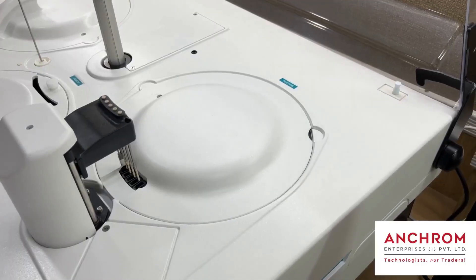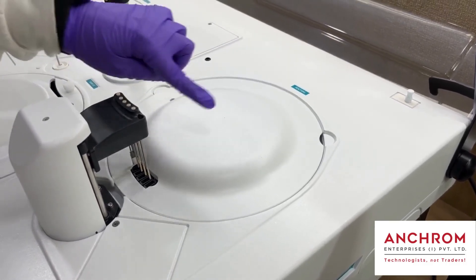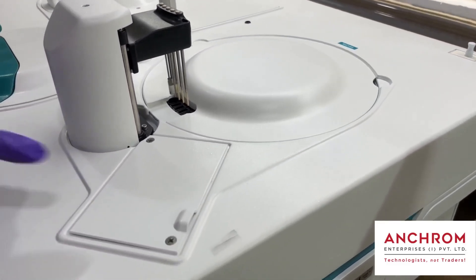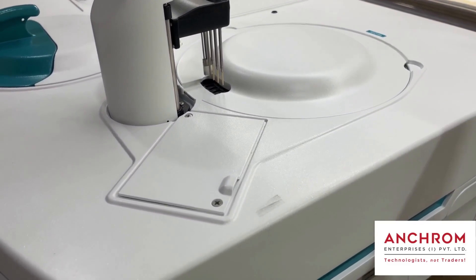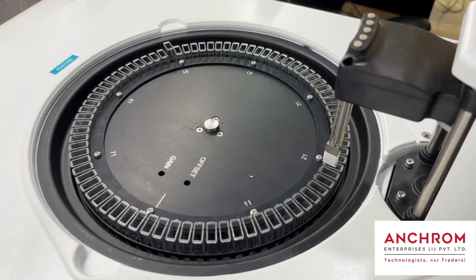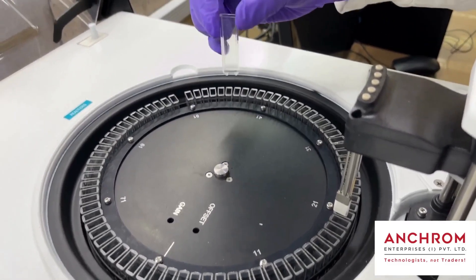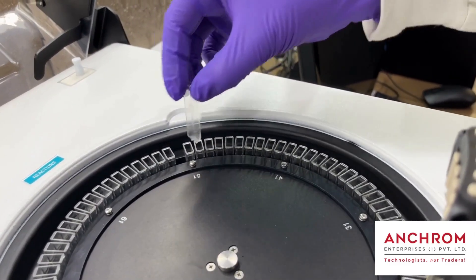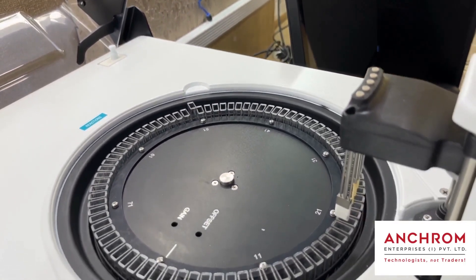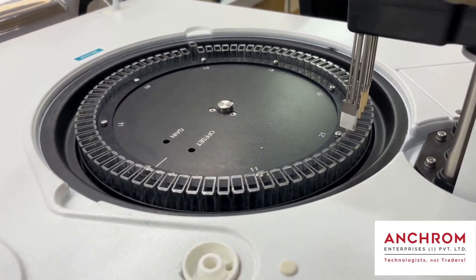Next is the Reaction Chamber, where the sample and reagents react and results are detected photometrically or electrochemically as per requirements. Results are recorded with the help of software. In SmartChem, you get reusable cuvettes made of styrene or optical glass, so they do not become a consumable in your laboratory, allowing you to reduce single-use plastic waste and be more environmentally friendly.